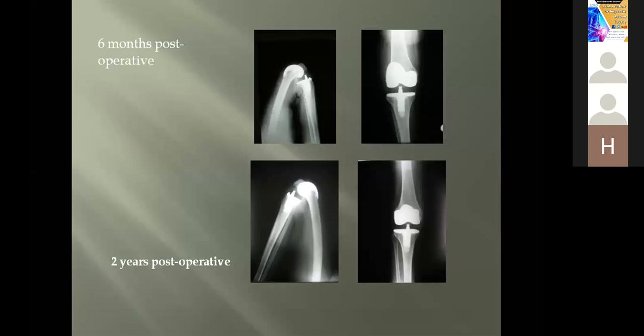This is one of my patients, 6 months postoperative and 2 years postoperative. You have the range. As long as the patient has a good preoperative range, you can reach this range, but you have to warn your patient, this is not for everyday use. This is not for use five times a day. This is to be used when needed, when you need this degree of flexion, such as going in and out of the car, or getting up from a low chair, and such circumstances.